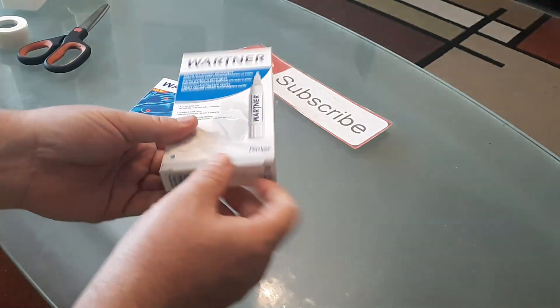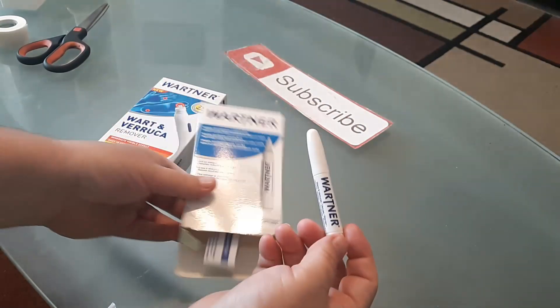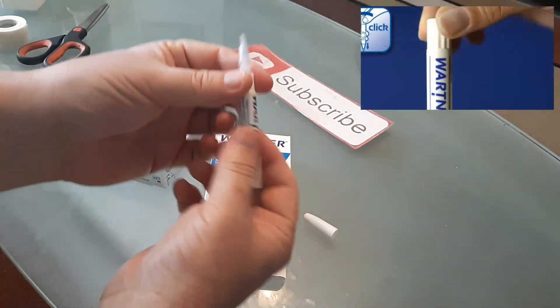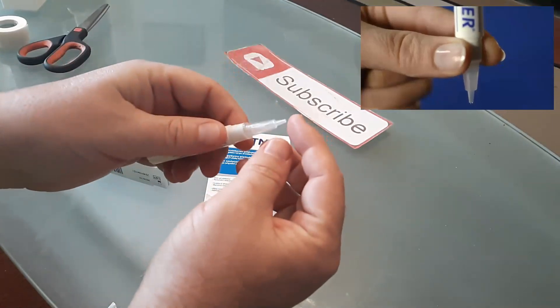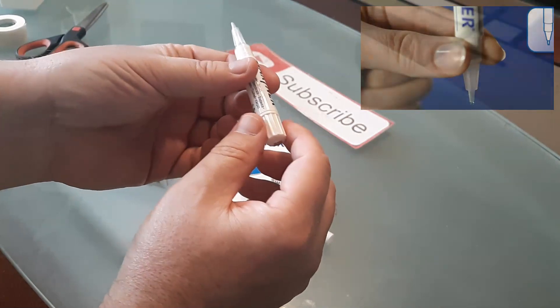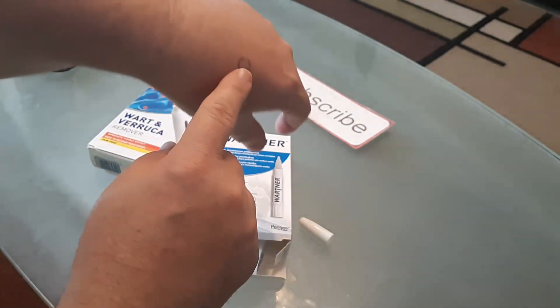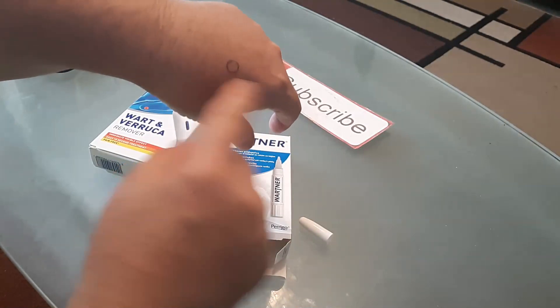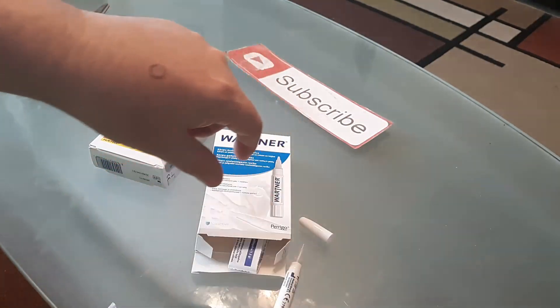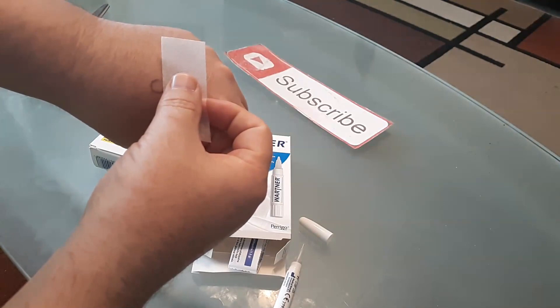Let me go ahead and open one up — it comes in a little pin like this. You remove the cap here, take a little scissors and cut right at the tip, then turn clockwise until you get one little drip out. I went ahead and marked on my hand where a wart would be, since I don't have any currently.